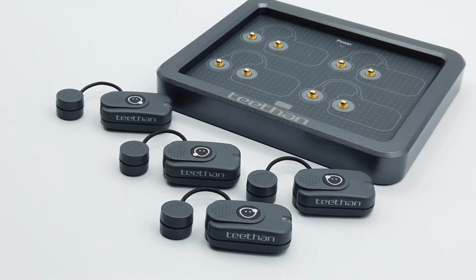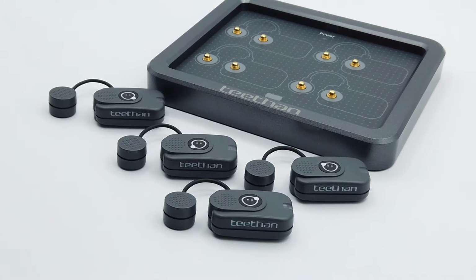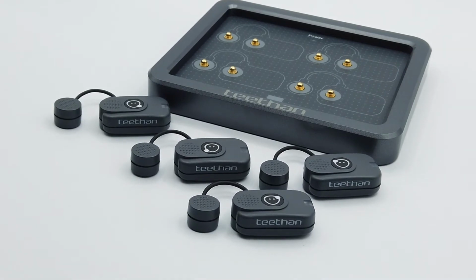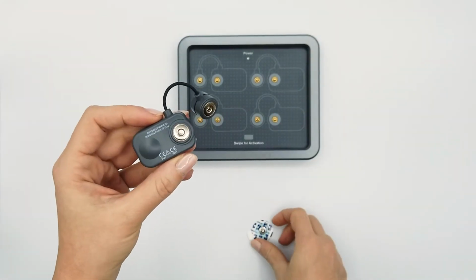Placing the probes on the patient. After inserting the USB receiver and activating the probes, it is necessary to place the probes on the patient's face, on the masseters and temporalis anterior muscles. Each probe is dedicated to the acquisition of a specific muscle that is shown on the Teethan logo.